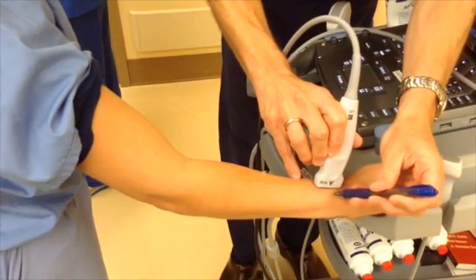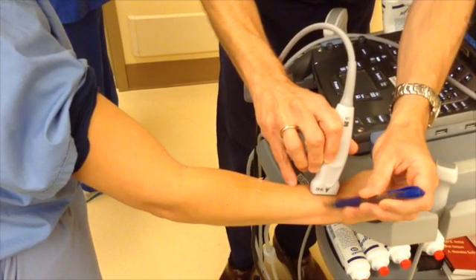Then mark this with a pen on the patient's skin, making the mark a couple centimeters away from where you will be sterilizing and injecting.